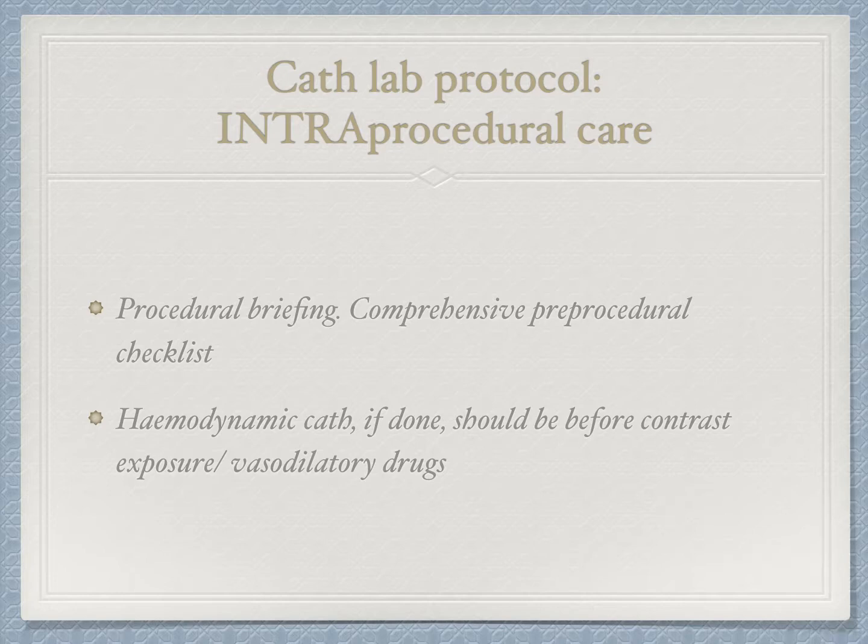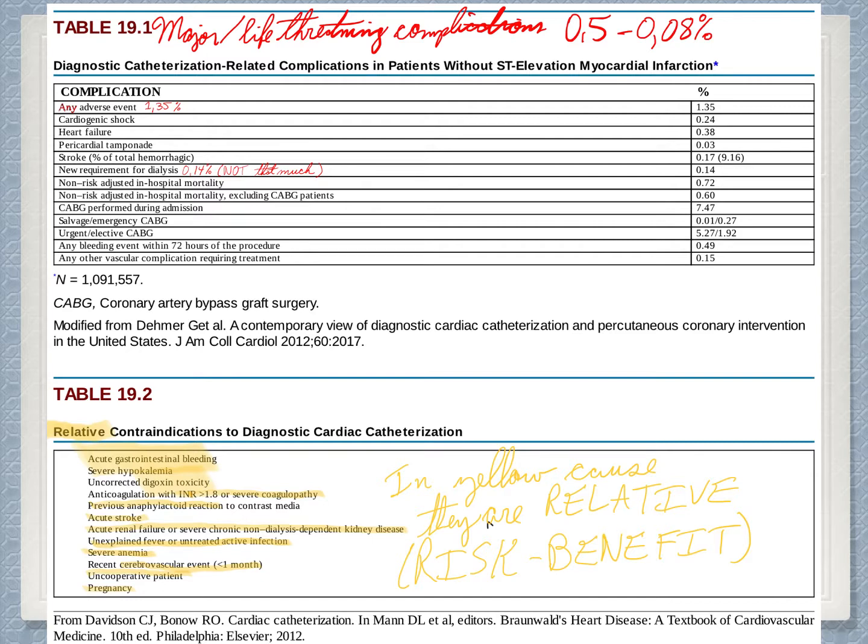Intraprocedural care: if you want to do hemodynamic measurements, do this before using contrast or vasodilatory drugs, which will change the results. These are the major complications. 0.5 to 0.08% will have complications. This is pretty good news, and it's a pretty low number.